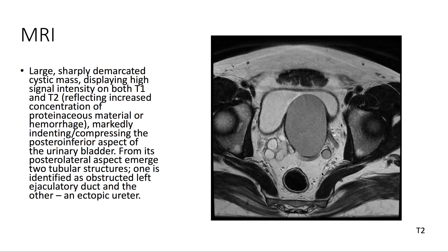On MRI, we again see a large, sharply demarcated cystic mass with high signal intensity on both T1 and T2-weighted imaging. It's markedly compressing the postero-inferior aspect of the urinary bladder. From its posterolateral aspect emerged two tubular structures, identified as an obstructed left ejaculatory duct and an ectopic ureter.